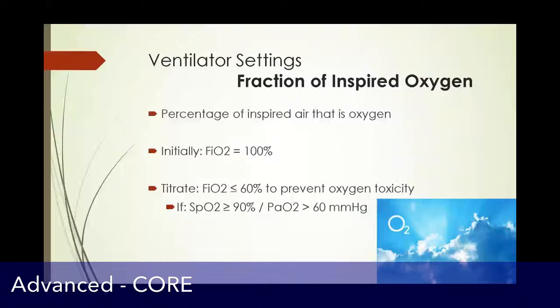Next is going to be your fraction of inspired oxygen. So again, this is fairly straightforward. This is the percentage of air that is oxygen that you're delivering into the lungs. So whenever you put someone on a ventilator, you want to start them on a fraction of inspired oxygen of 100%.